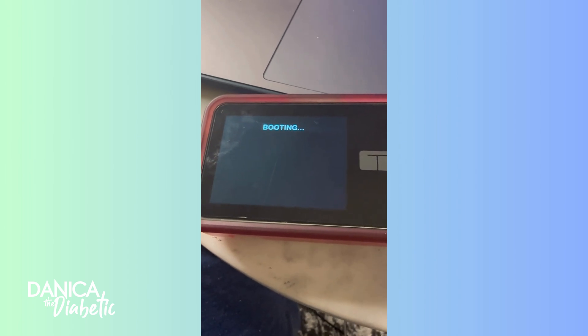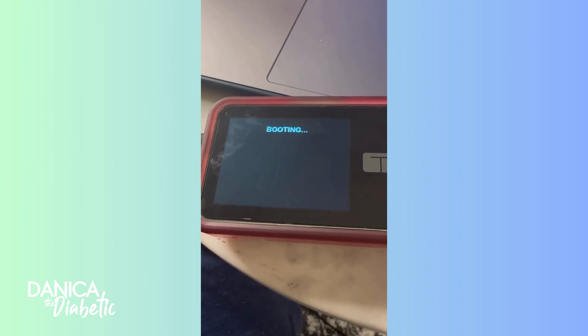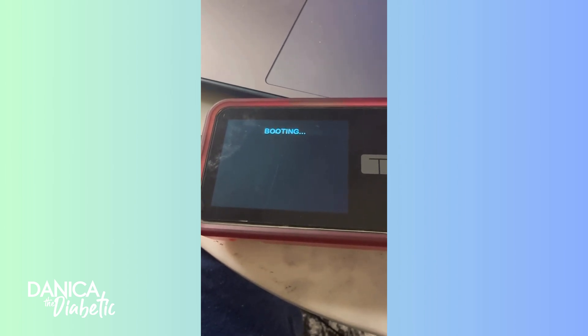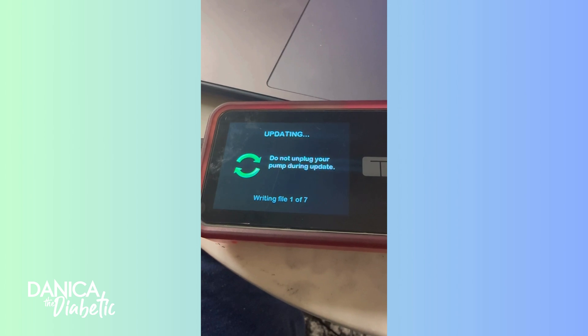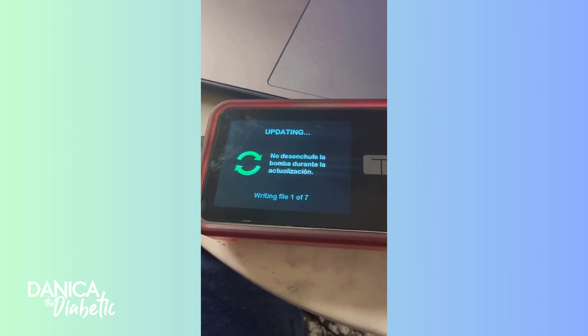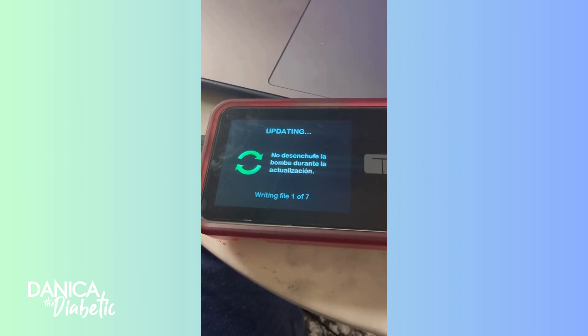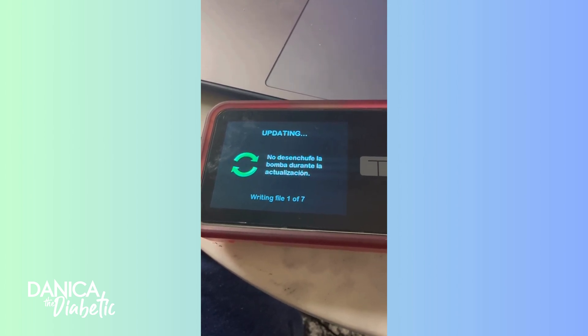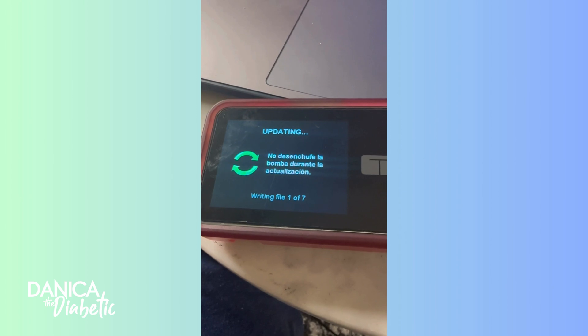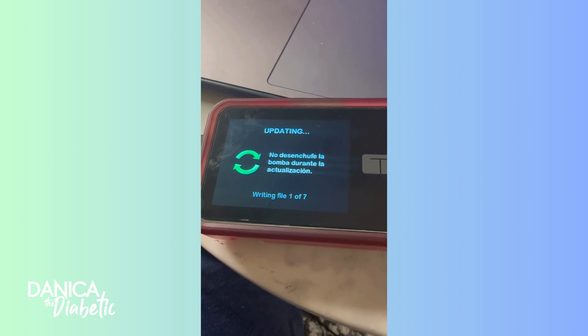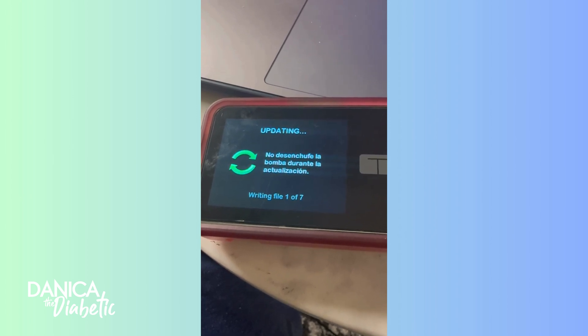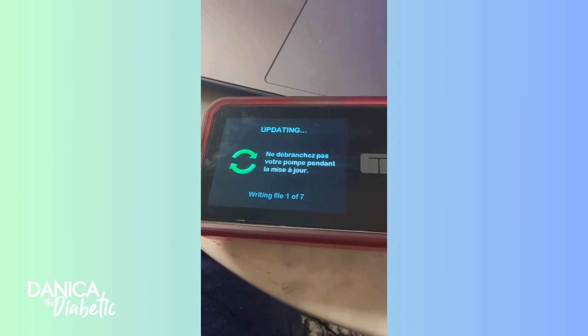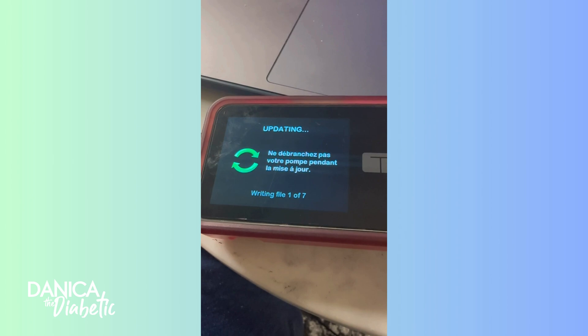Once it's good, you reboot your pump. It gives you a bunch of prompts. You just click it till it works. As you can see, my pump is struggling, but it eventually will reboot. And it just says booting for a little bit. Another important thing is keeping your pump plugged up during this whole time.